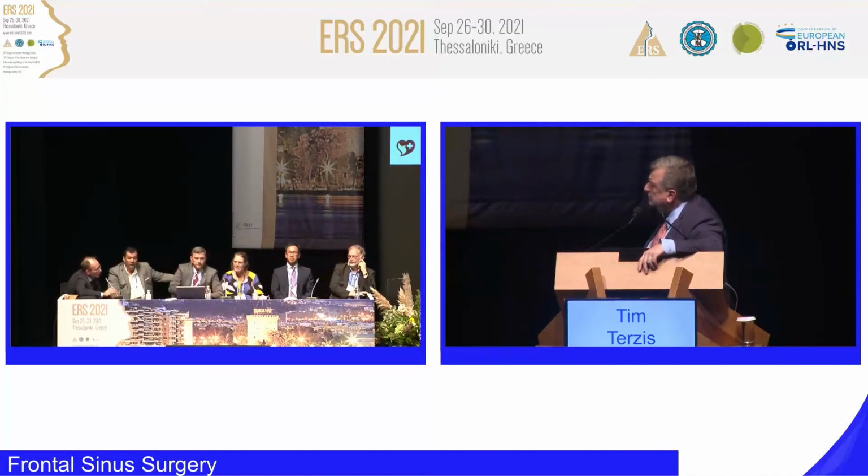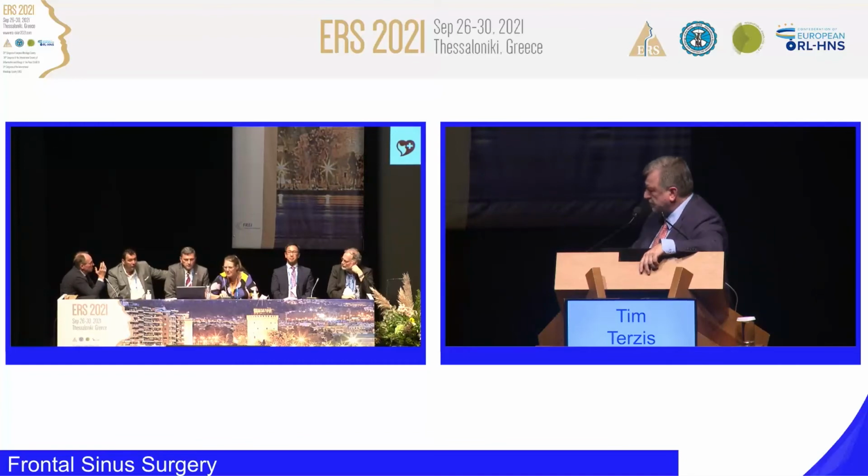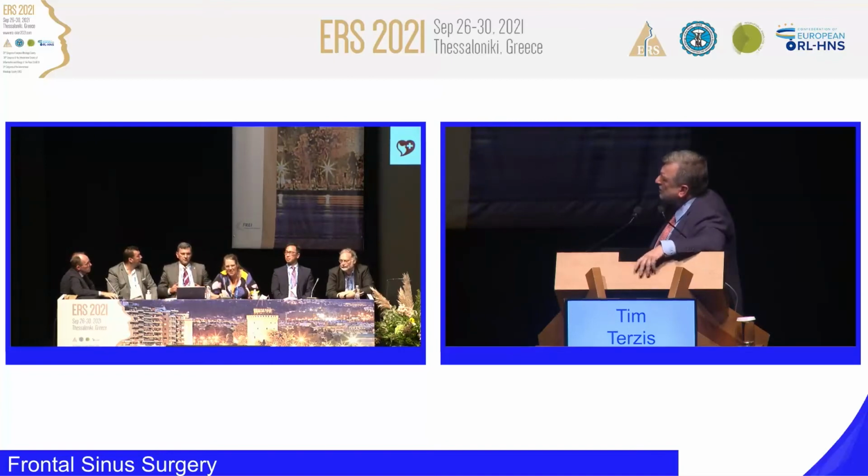Okay. And I would always be worried about the bone erosion on the posterior table of the frontal sinus. So this looks like something you have to think very carefully about. Okay. Don't you think that's a partial volume effect? I don't see a bone erosion. I can't hear you, Wytske. You need the full set, but I don't think so. Anybody else want to comment?